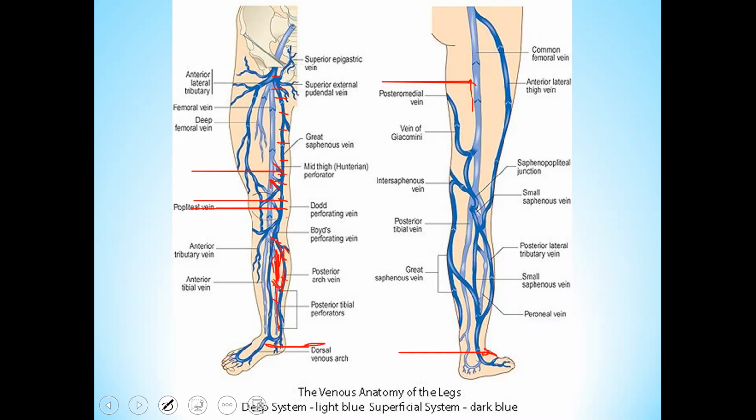So at the region where there is clot, that segment is bypassed with the help of the superficial venous system. In that case, there will be continuous or persistent deep to superficial blood flow in the perforator distal to the thrombus in the deep venous system.